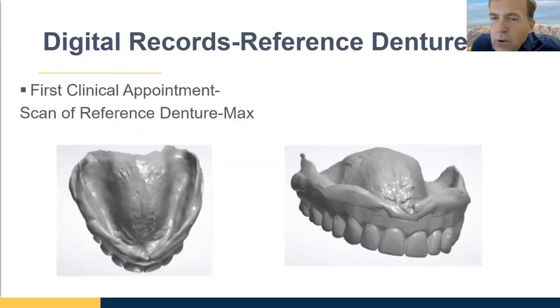That can be a little bit difficult, and it took me a long time to learn this one. For some reason, I always started, I guess because I'm a technician, on the teeth. I'd start on the occlusal aspect of the teeth, and I would have a heck of a time getting over this border to capture the intaglio surface. What I learned from Kelly is that I was doing it exactly backwards.